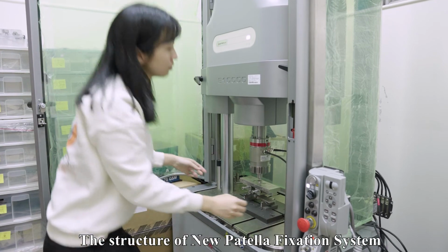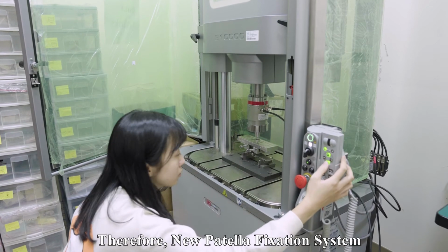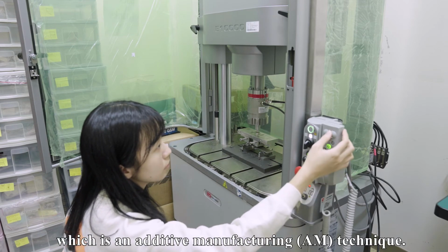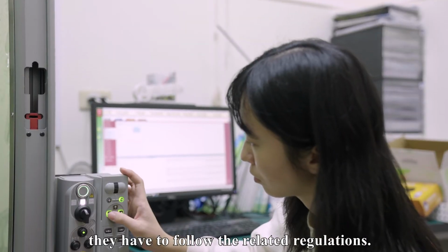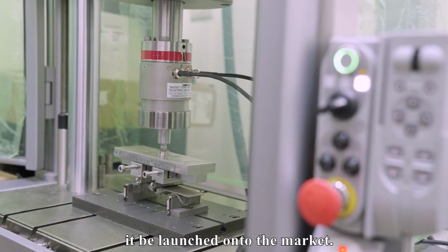The structure of the new patella fixation system is complicated, and it's hard to manufacture by a general machining process. Therefore, the new patella fixation system is manufactured by DMLS, which is an additive manufacturing technique. When the final products are complete, they have to follow the related regulations. Hence, only if the medical implant passes the preclinical testing should it be launched onto the market.